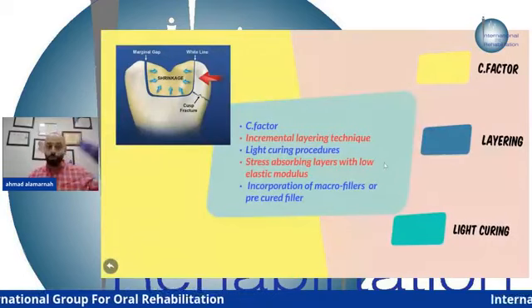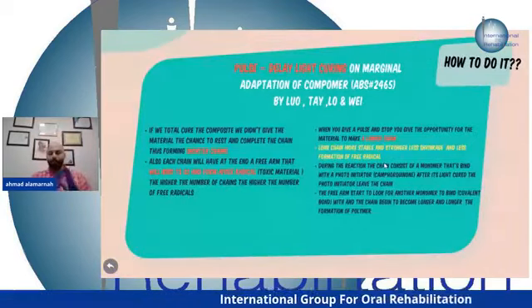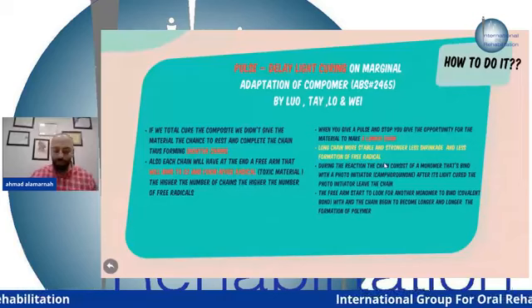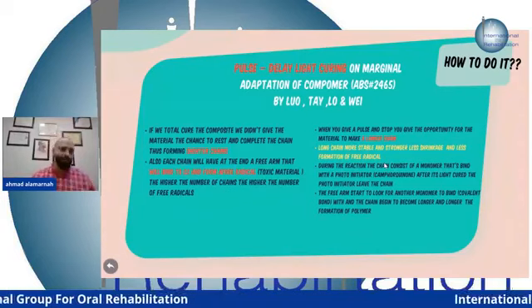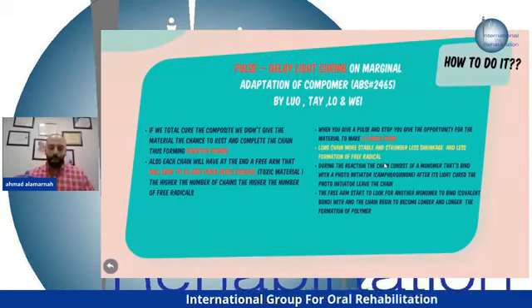So how to manage that? We are going to talk about the light curing. The idea is to use a pulse delayed light curing. What's the pulse delayed? The material is like a living creature, okay? You have to treat it well to have the best results from it. So how can we treat it?